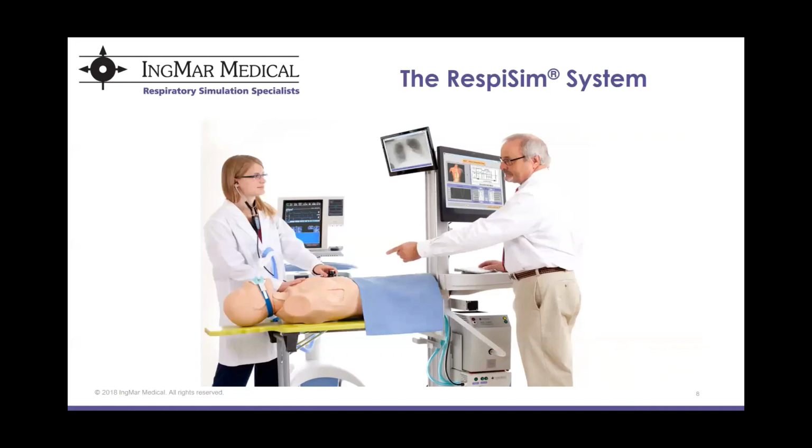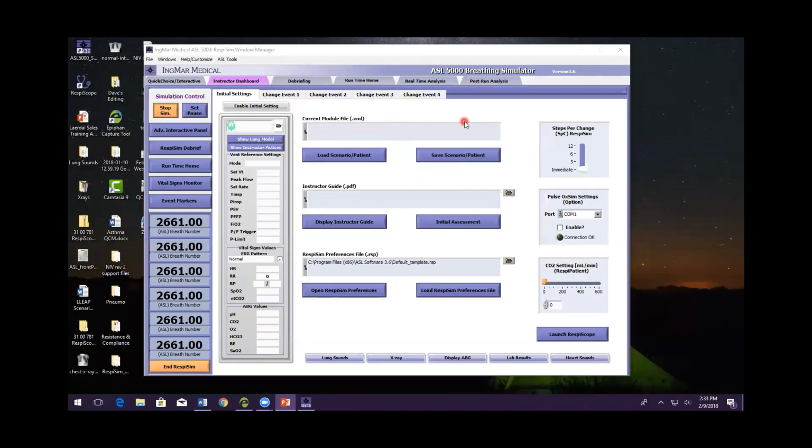So we have a couple questions here related to our curriculum modules. Our curriculum modules are the scenarios that we've been building here internally for our customers. And so let me go back quickly to the software program. So the first question here is, how do you open a module that you have created and saved before? And so within this instructor dashboard environment, this is where you would be loading and running your curriculum modules, whether those are ones that you've created on your own or ones that we've built. In either case, you would be loading your scenario or patient here with this button on the initial settings under the instructor dashboard. So then that, of course, sort of depends on where you specifically save that.